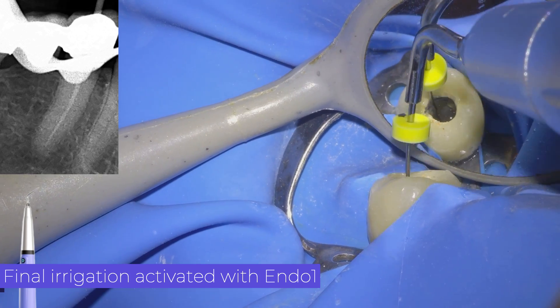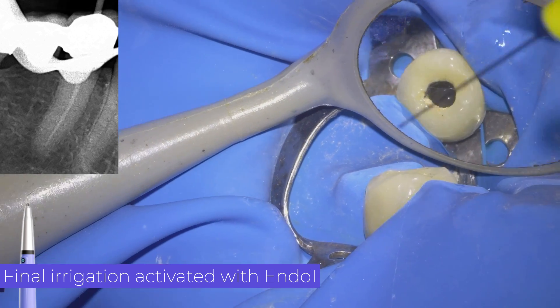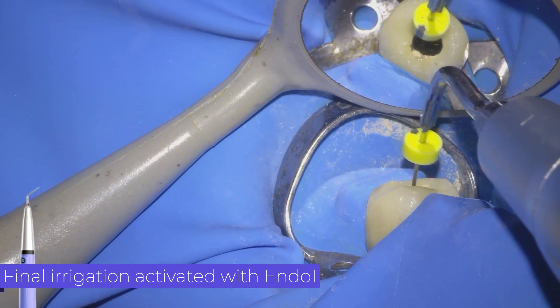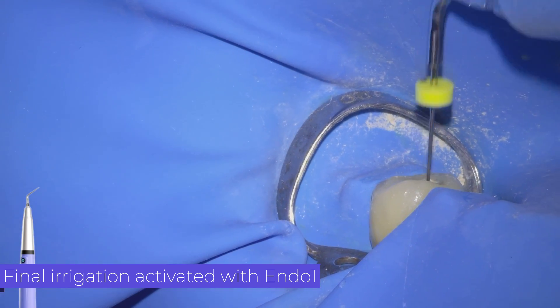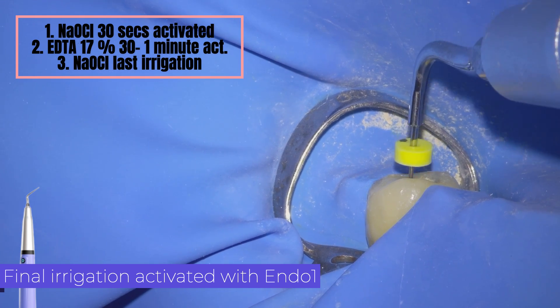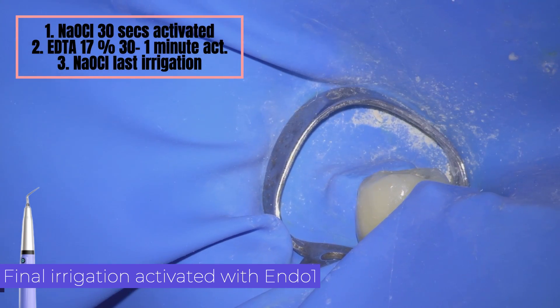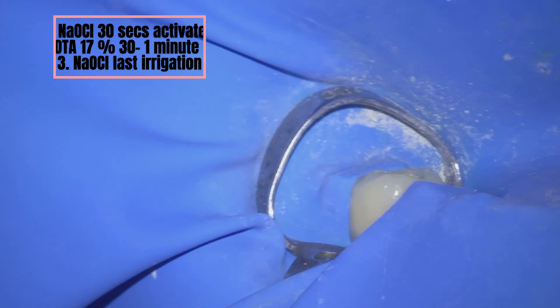The protocol I usually use is simple. First, the canal is filled with sodium hypochlorite and activated for about 30 seconds per canal; the debris generated is then flushed with 3 milliliters. Second, the canal is filled with EDTA 17% and activated for 30 seconds to 1 minute. As the last irrigation, sodium hypochlorite is used again, to neutralize the EDTA and to access the organic tissue that was hiding under the smear layer.